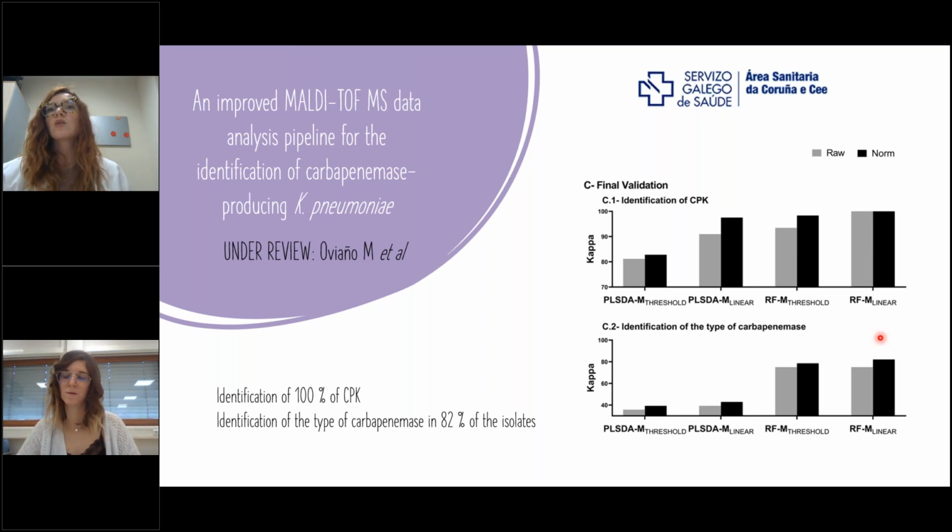But we would like to keep working on this to increase our collection of isolates, because this was a survey that we performed in Spain with more than 400 isolates. But it is true that in Spain we have a clearly higher prevalence of OXA-48. So we are working on this, but it is really interesting and we have very good results.